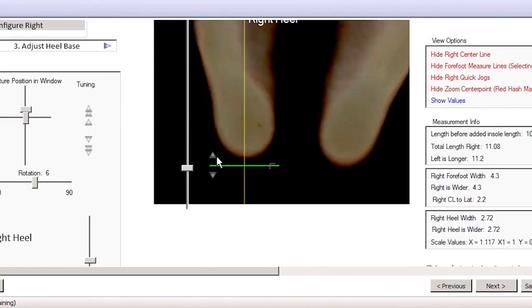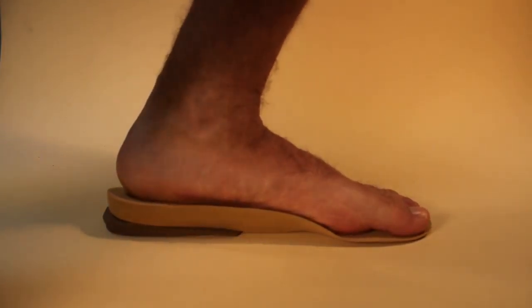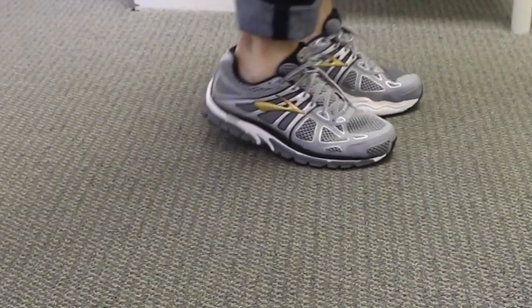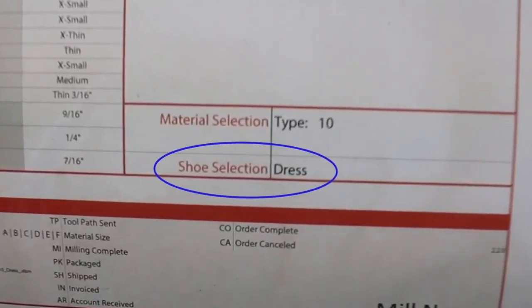Orthoses are designed specifically to the dimensions of the individual foot and correspond directly to the anatomical configuration of the patient. Please ensure that you fit the orthotic into the shoe type they were prescribed for. That shoe is listed on the prescription summary you receive in the package.